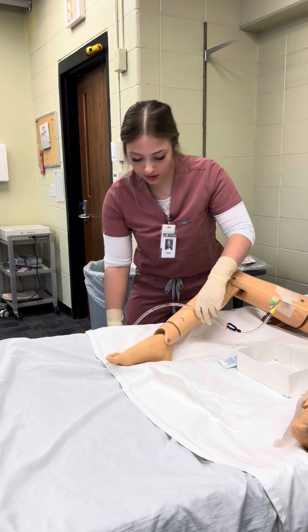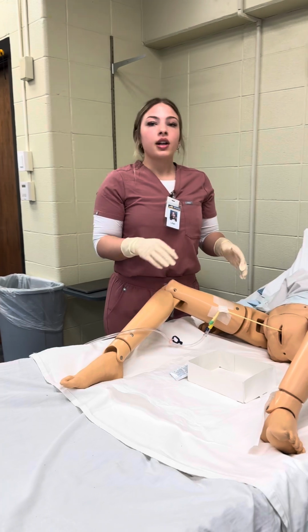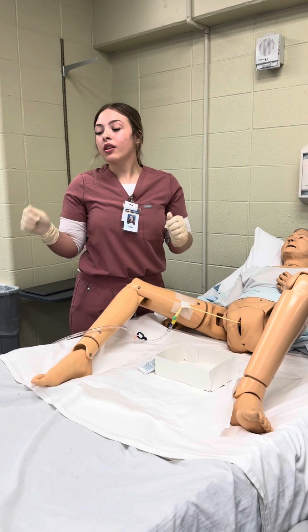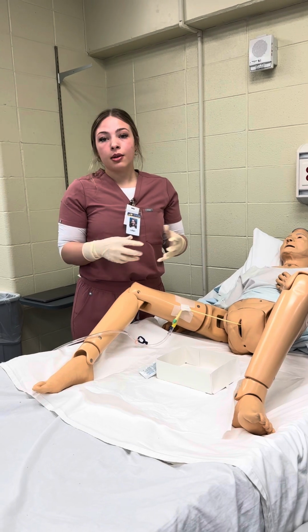Make sure it's secured. And then once I'm finished, I will clean up my supplies, take off my gloves, perform hand hygiene, and assess the patient's response and document immediately.